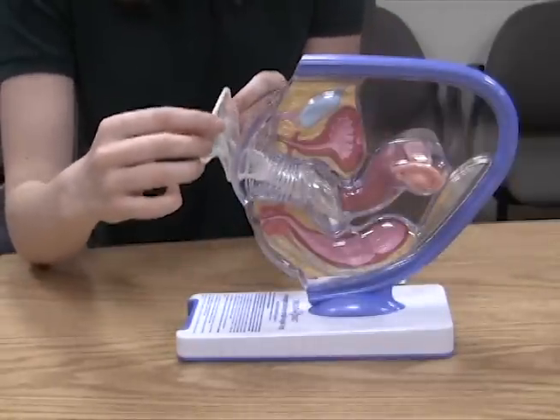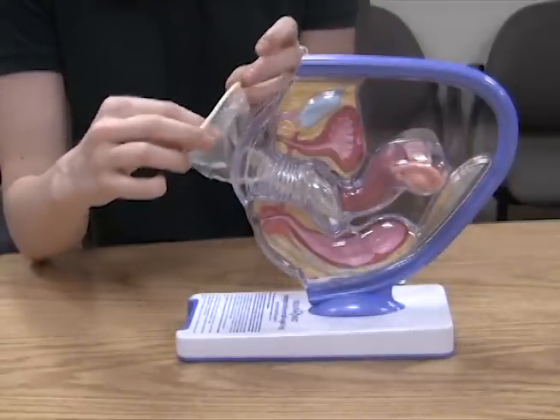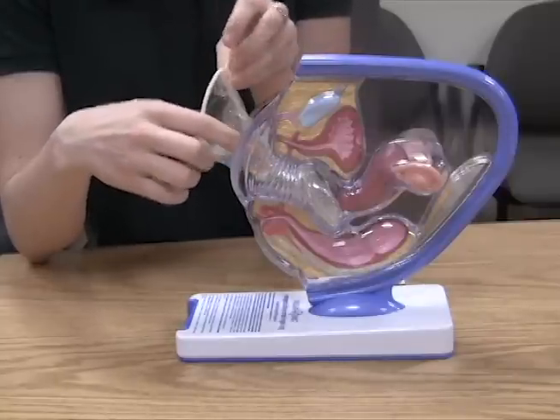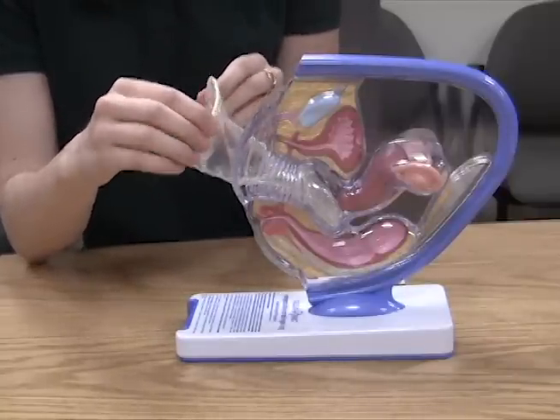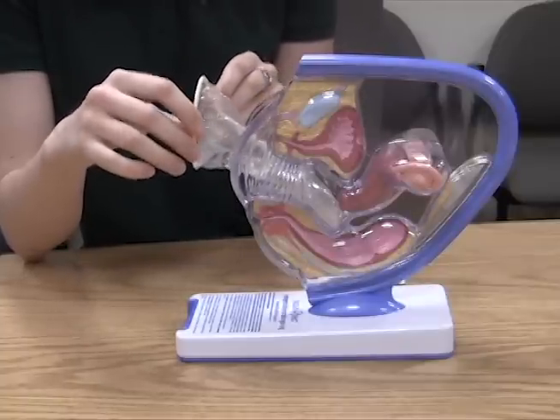During intercourse, you want to make sure the outer ring is covering the labia and that you insert the penis through the condom, and that it doesn't slip alongside the condom into the vagina. You also want to make sure you don't use a female condom with a male condom — you should only use one or the other.